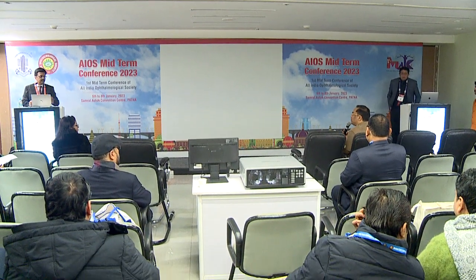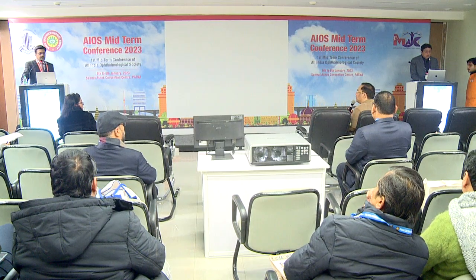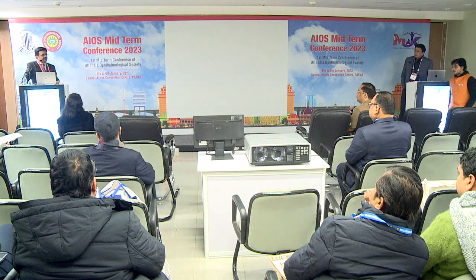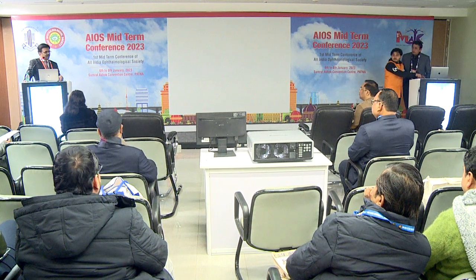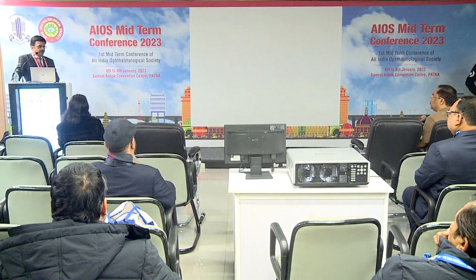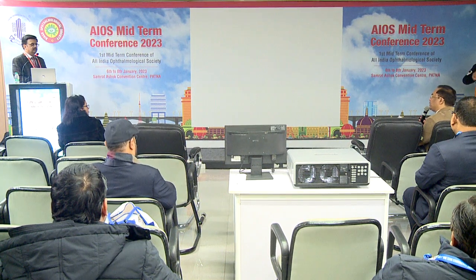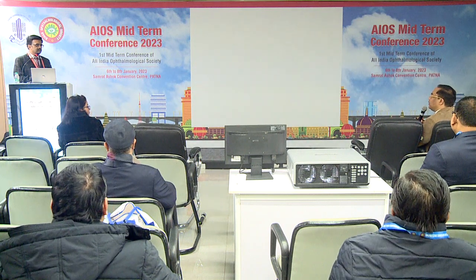These surgeries that you have done are on high-end machines like Centurion. But what would your message be for the general ophthalmologists who do not have high-end machines? See, if you keep the parameters a bit low, with less turbulence in the AC, all machines, once you are working with a machine, you know how to handle it, even if it is a low-end machine. So low parameters and less turbulence will help you prevent vitreous loss in such cases. These were pre-existing PC tears which were seen once you had finished emulsifying the nucleus.